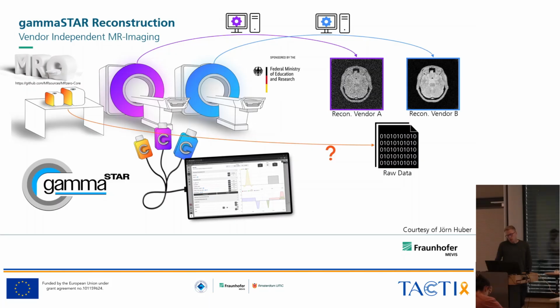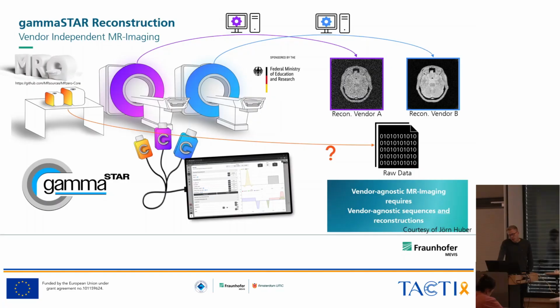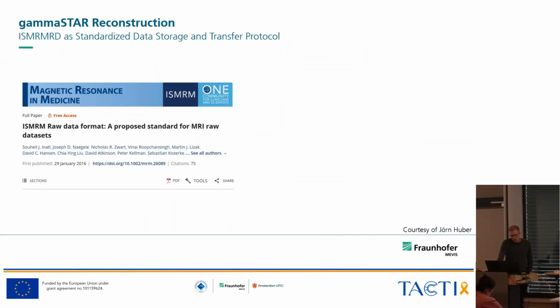And for those, it would be really nice to have the exact same reconstruction framework, which is capable of reconstructing data from these large systems, from simulators, from tabletop systems, so you're really sure that the exact same reconstruction steps are happening every time. And that is why we basically started developing this reconstruction framework for gammaSTAR sequences.